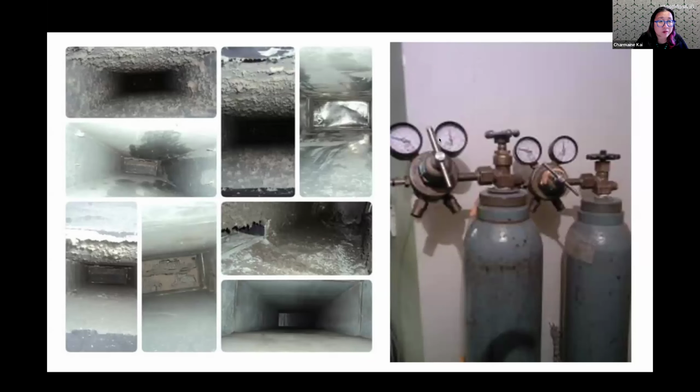Yes, absolutely. Maintenance is really important for air filters. You can't just leave them in and hope that you never need to change them. So location of air filters is really important. Ideally, you don't want them within the lab. You want to have them outside the lab so you don't have work people coming in to change filters within your lab. That is something to think about as well.